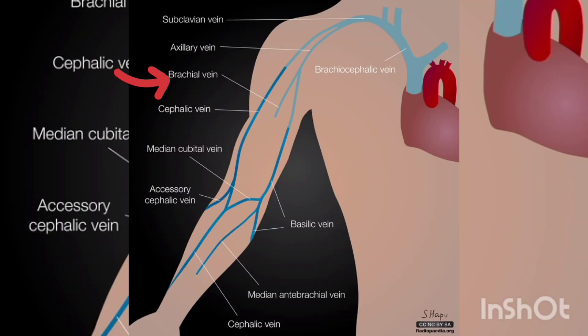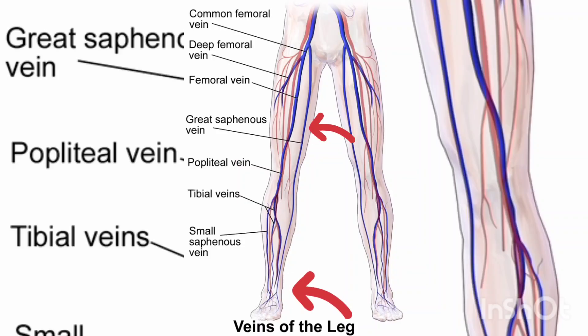PICC line can be inserted in upper or lower limb larger veins. Here, we will insert in the left great saphenous vein, and the PICC line will travel to the left common femoral vein, to the left external iliac vein, to the left common iliac vein, and ultimately into the inferior vena cava.